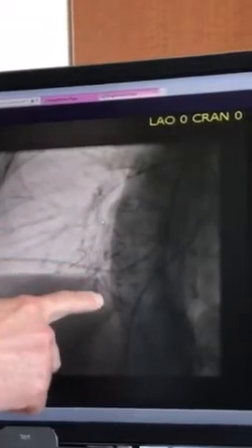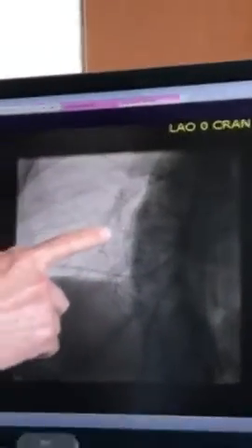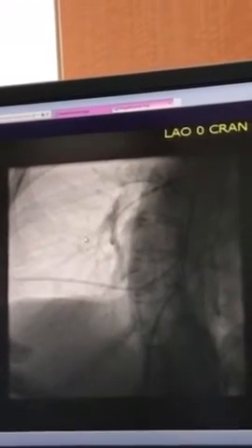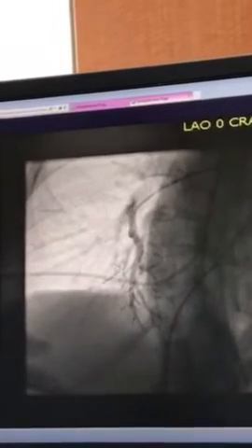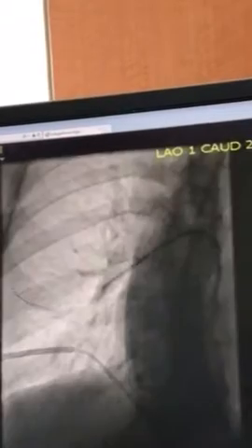And this is that posterior basal vessel, so it's the back, sort of lower part of that right lung. And there's clot based on how irregular it's filling all throughout this thing. We've already worked on this, sort of ballooning it. You see there's a bigger branch here and then a bigger branch here. And so if we just go to today's view, or yesterday's view, sorry.